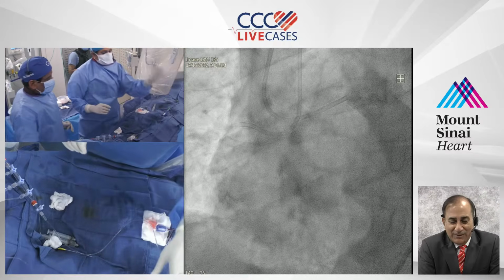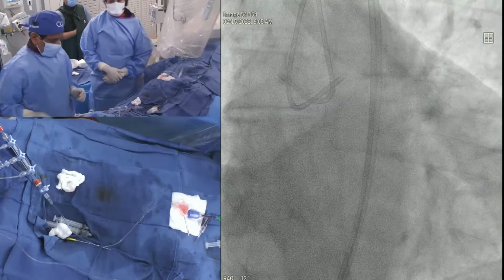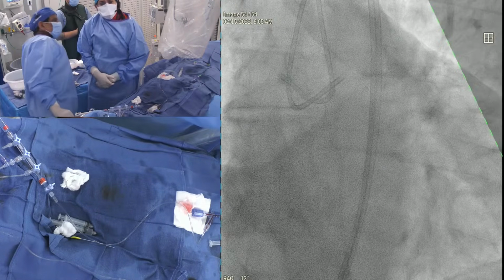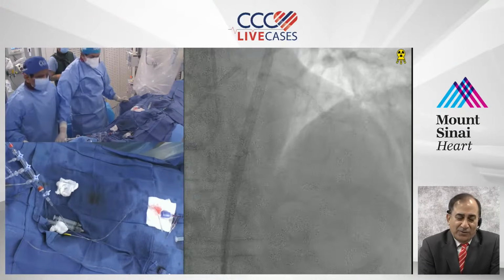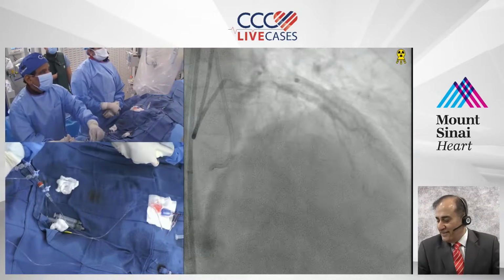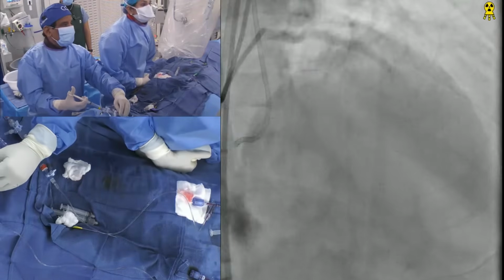Okay. So even if you had wires, you have to remember, these are very old generation wires. Your one-to-one torque doesn't exist. That is with your Hornet as well as Progress 200 and Fielder. Another very interesting revelation for me over the last several cases has been that before, almost 90% of people used to ask the question, and now it has moved completely. Beautiful, as long as the question has been answered.